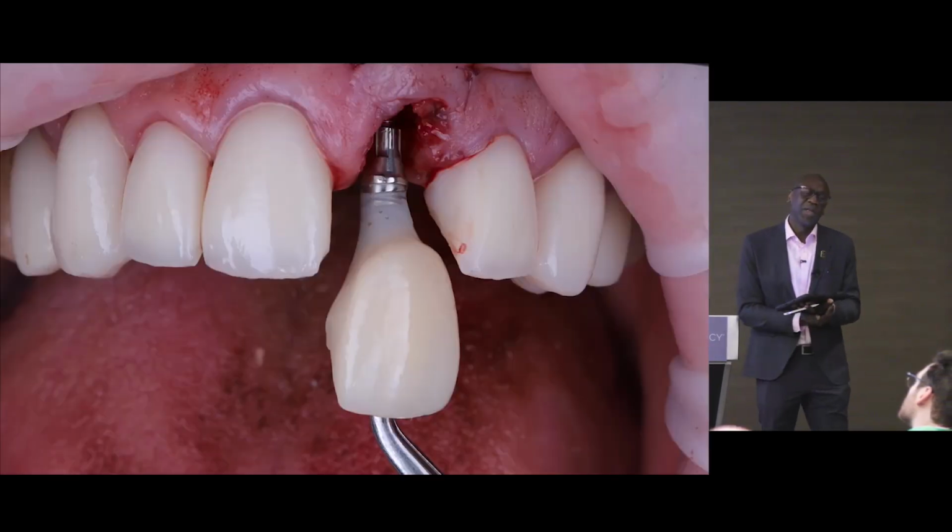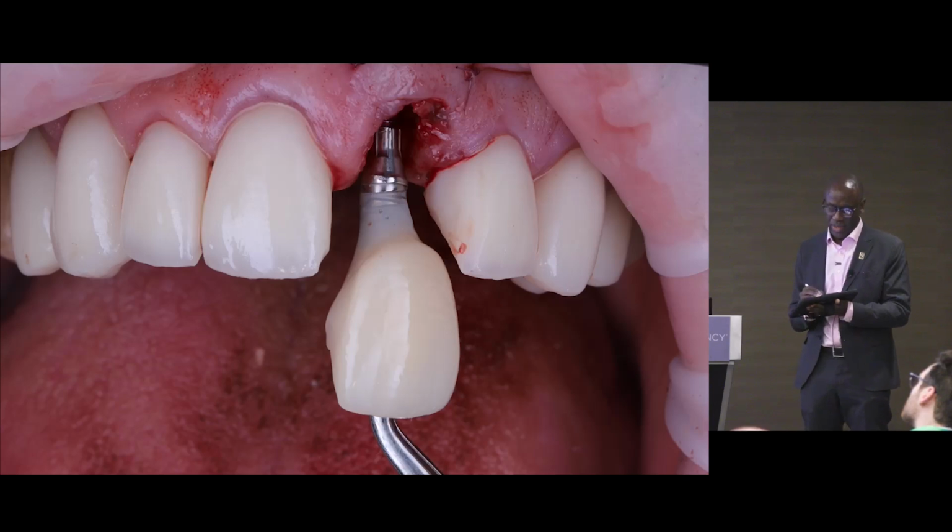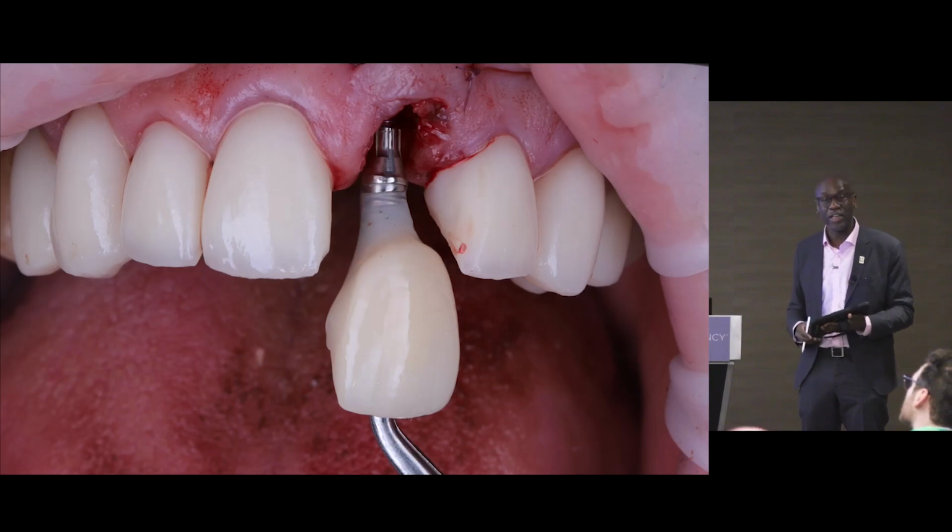We also talked a little bit about the chimney height. So what you see here is a patient who's had an immediate implant. This is the standard chimney. It goes to roughly, let's say, that height, and we can see the crown on top of that. Now this patient went away, as he did, and he was told to come back. He didn't, and he fractured that.